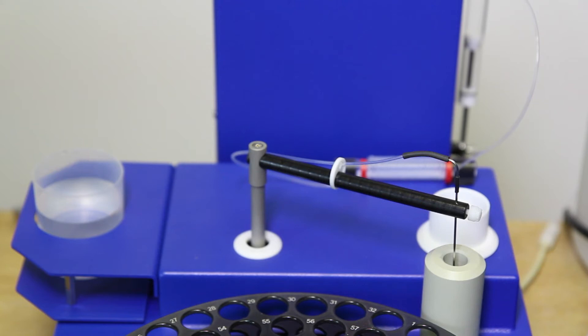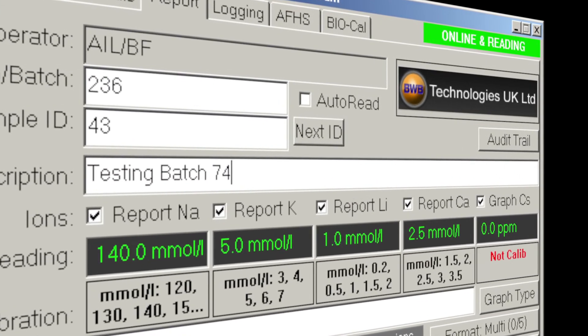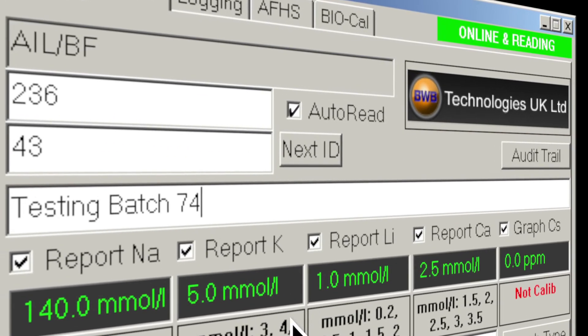Each result will be printed, if the printer is on, and sent to the FPPC software. These can be captured in the report tab by checking the auto-read checkbox.